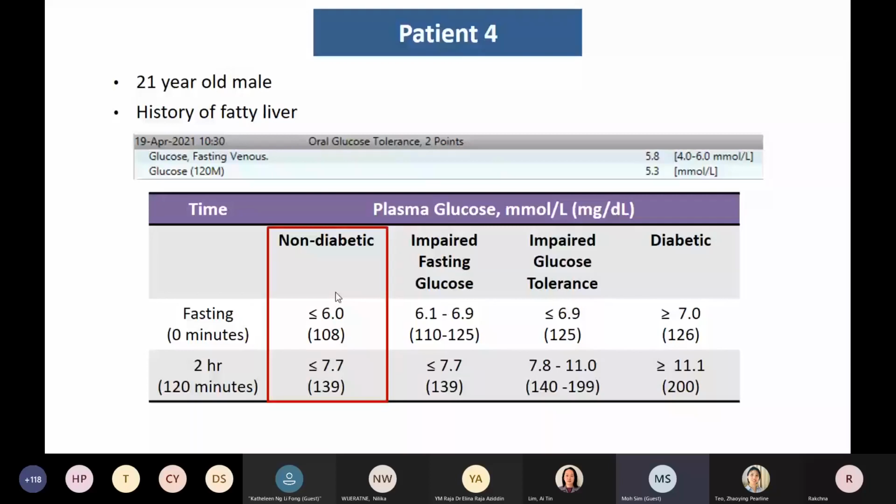And I think it's therefore important to make sure that your patients actually understand that they do need to not move around during the course of the 2 hours, because it does change the validity of the test.